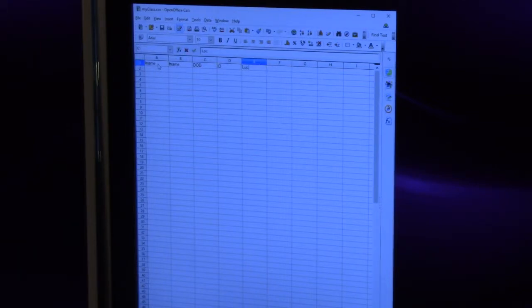In our case, we don't use ID numbers much, so we're going to just make up some numbers. Then the location, which is a column again that we don't use, so we will make up data for that. And contact. You might wish to put in a generic local Lions Club email address. If the school nurse wants to put the school nurse's address in there, that's probably more appropriate for the school setting. Today we're just going to put something in there.